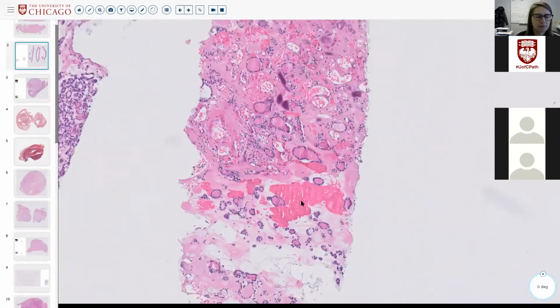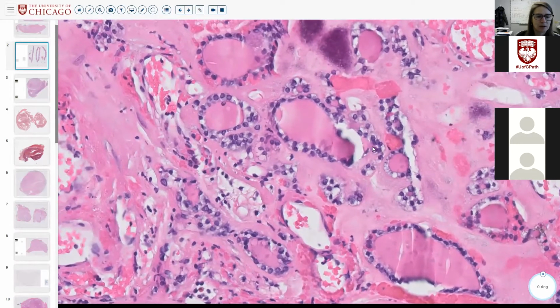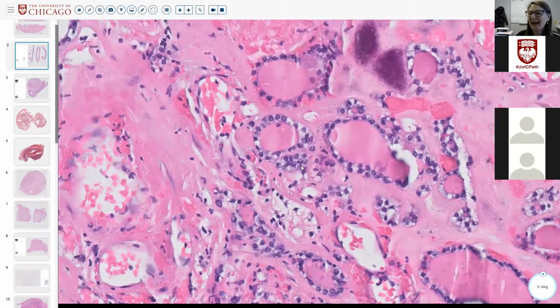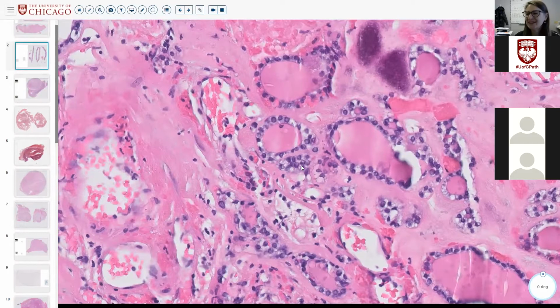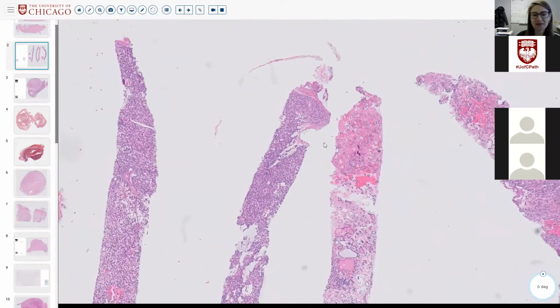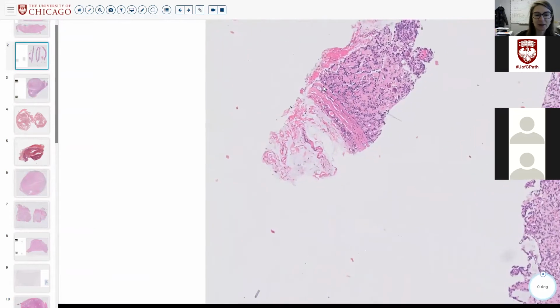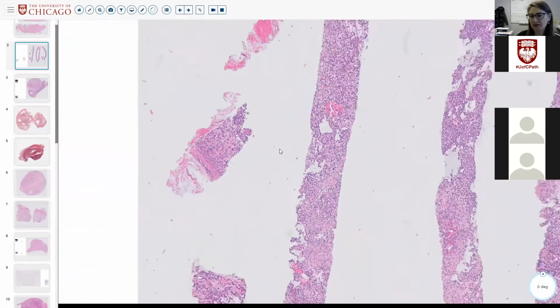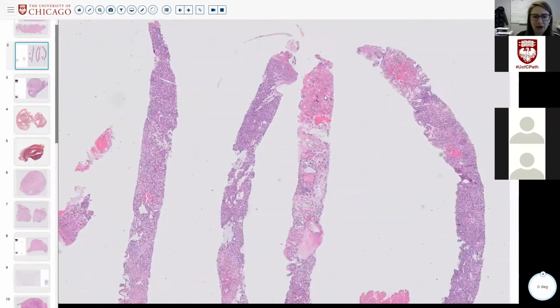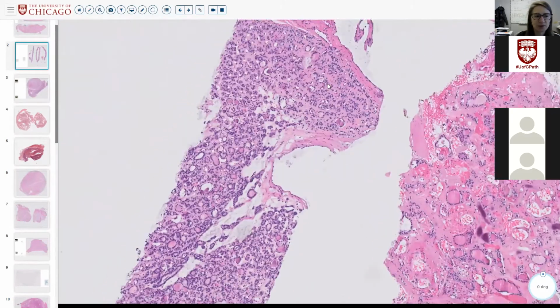God, like a suspicious? No, that's too high. So I'm just going to summarize and you guys think. It seems to be lesional, right? This doesn't look like normal thyroid like we saw in the last case. There is maybe an edge, maybe a capsule, either a capsule of the gland or a capsule of the nodule probably. Here's another edge, right, where there's maybe a little capsule.